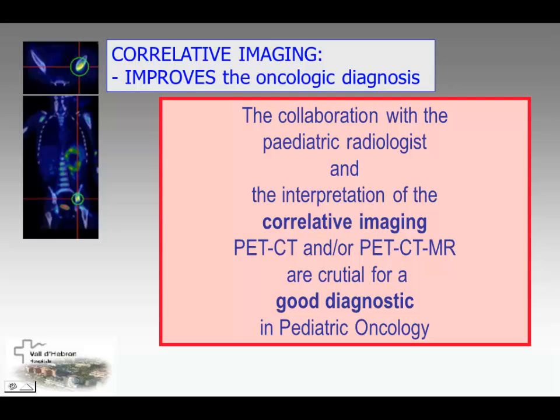Chloral hydrate is, if I am well informed, used in small children, but in babies we don't need any sedation because we can use the relaxed state after the milk. In any case, we don't like to perform sedation or anesthesia in our children, and for this reason we ask the pediatric radiology department of our hospital to come to our department when anesthesia is required. But we don't administer chloral hydrate ourselves. And in babies under 12 months, we never administer sedation.